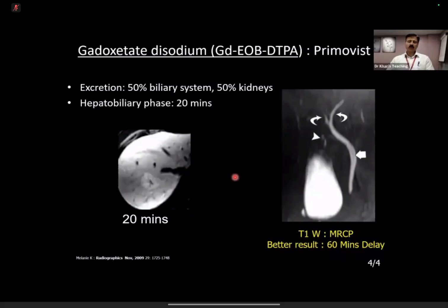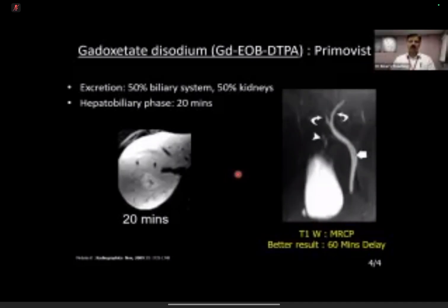The technique which we use, I have got an experience of about, I think, 12 or 13 cases which we have done. And this is very unusual to do. We will only do it if we cannot do the other bits. So this is not the answer for your FRCR, but it might be a distinction question or a scenario where you can impress the examiner by your knowledge. Basically, nuclear scan is up there, but if nuclear scan is not there, ERCP you can do, which is a bit invasive, and you can also do this technique if both are not available, or for some reason you cannot do an ERCP. Please remember, MRCP or PTC is the wrong answer.